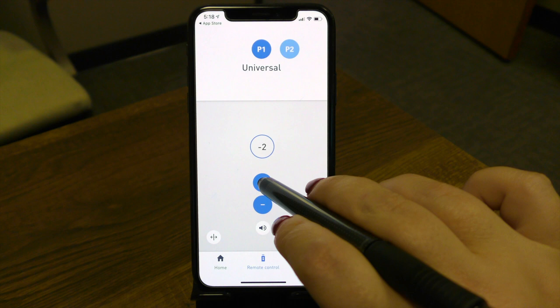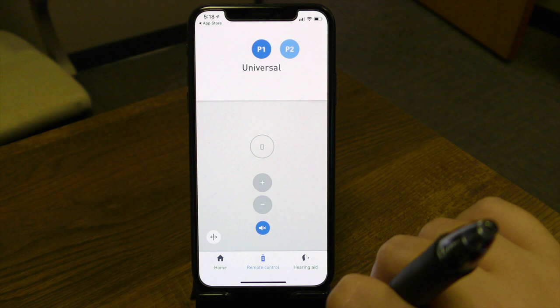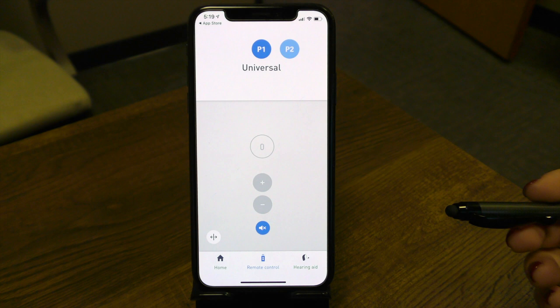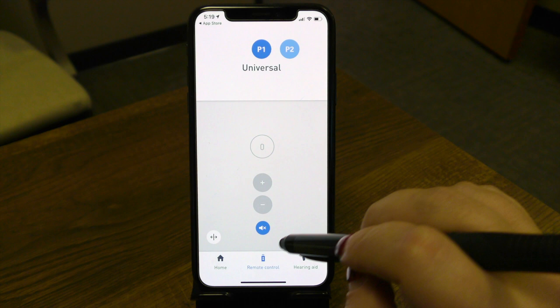To get back to that middle zero, we're going to increase the volume here. If for any reason you actually need to mute the hearing devices, you can — press this button here. I wouldn't leave your hearing devices muted for extended periods of time, because keep in mind the Bluetooth connection is still going and your hearing devices are still running. Even though it's muted, the aids themselves are not turned off. If that's your goal, I would truly turn off the hearing devices. But if this is just for a few seconds or even a few minutes, you could leave them on mute — just as a tip to save your battery life.